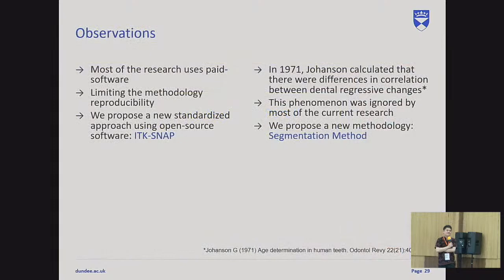First problem, the software that is used is paid, selalu berbayar. And that is really limiting on the methodology reproducibility. So we propose a new standardized measurement in ITK-SNAP. ITK-SNAP is really light. You can use it anywhere. You can download it now for free.